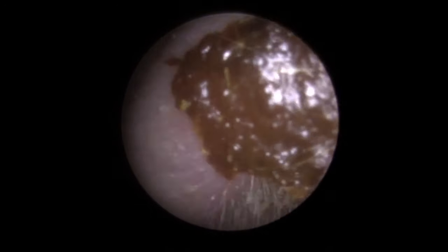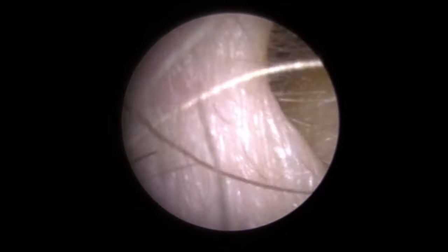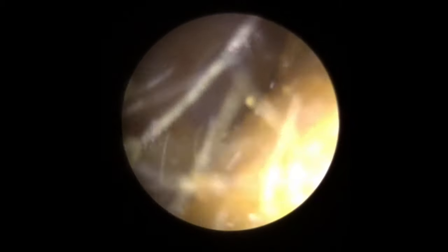You can see sometimes the entrance to the canals is a little bit narrower, so as you're trying to pull the wax through it actually starts breaking pieces away. Here we go — and out it comes. And there we are — we can see the eardrum now, looking nice and healthy. Just taking that one away there.